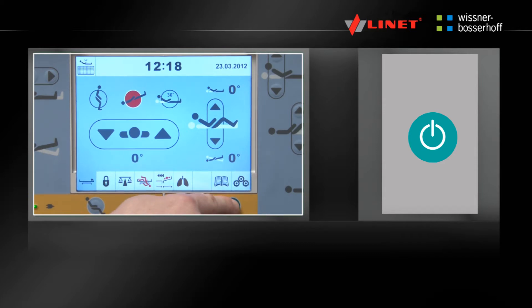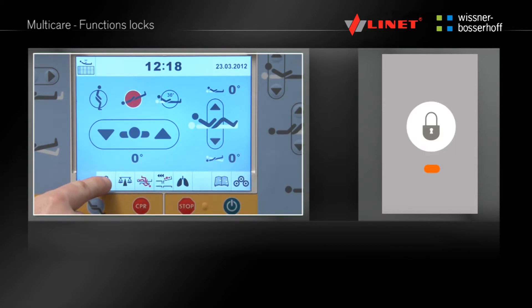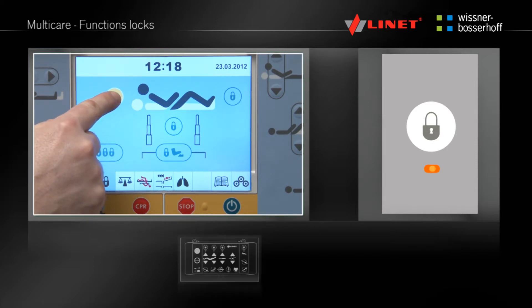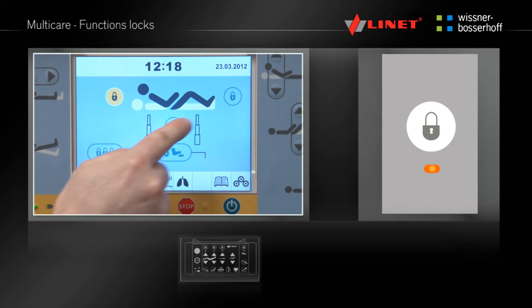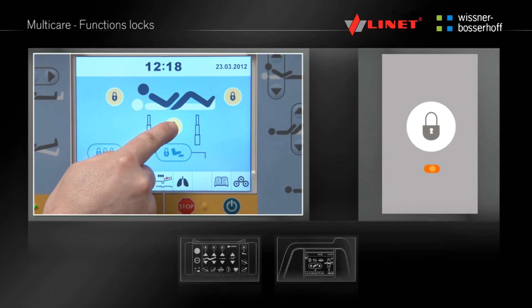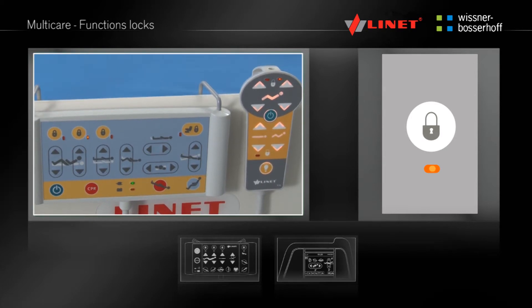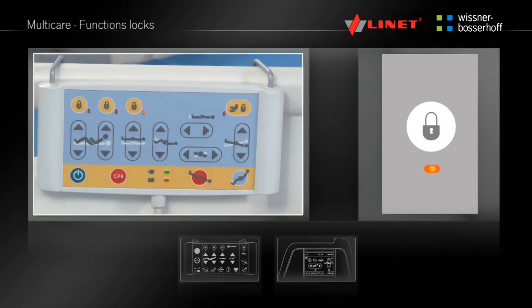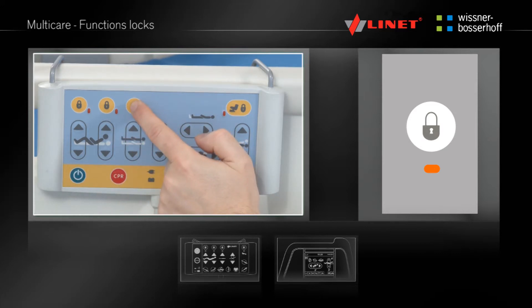Activate the function by pressing the Go button. Press the Lock button located on the Supervisor panel above the chosen function, or in the Lock menu on the multiboard — now the respective function is locked. The functions are locked on all the control elements. The locked functions are indicated on the Supervisor panel by small yellow indicator lights above the respective functions. To reactivate the function press the respective lock button again. The function is active when the yellow indicator light is off.